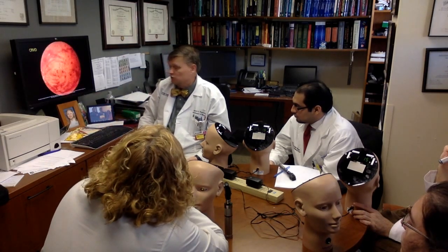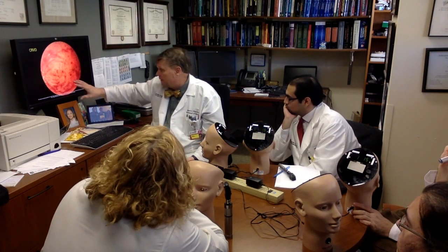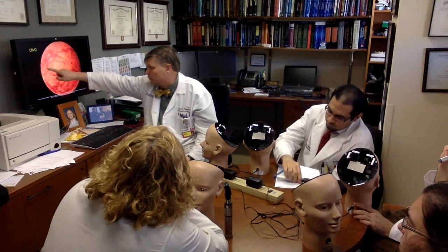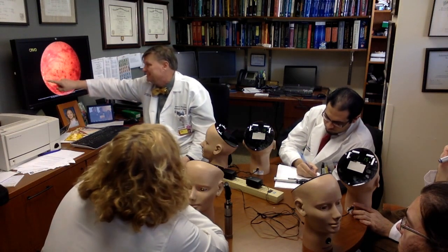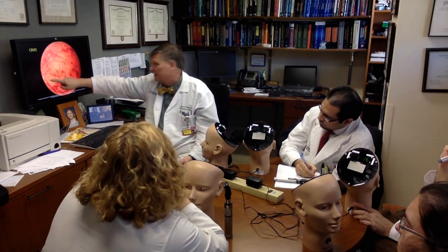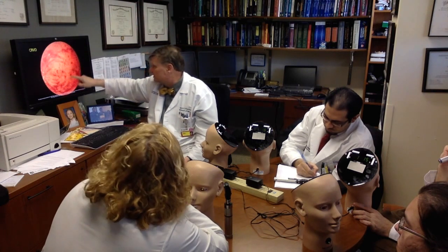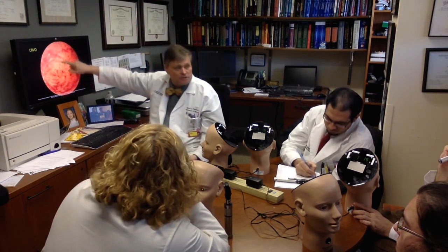So, let's look at this one. Oh my God. You can probably guess that this is supposed to be here, but it's been totally obliterated. We see no cup, we see no margins, but we see these cotton wool spots. Then we see flame hemorrhage. Then out here in the retina, we see all these dot and blot hemorrhages.